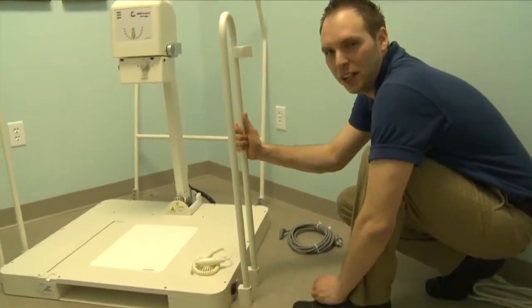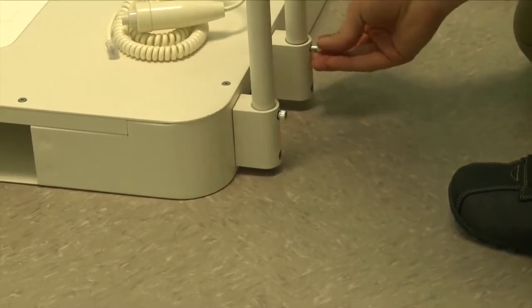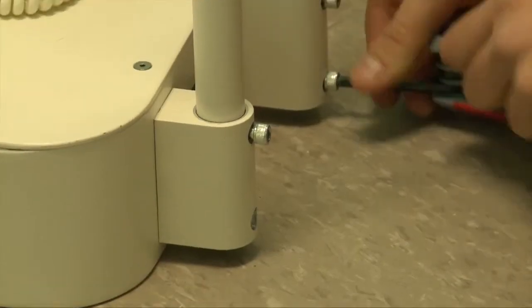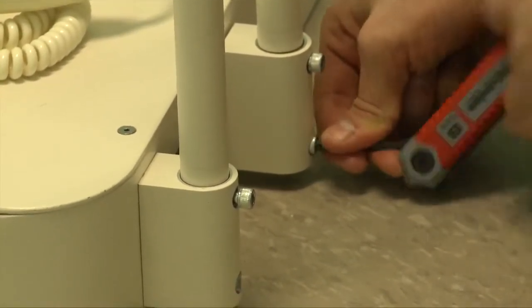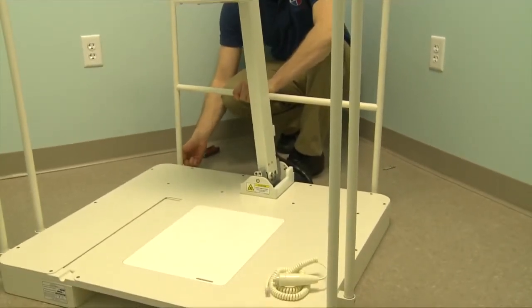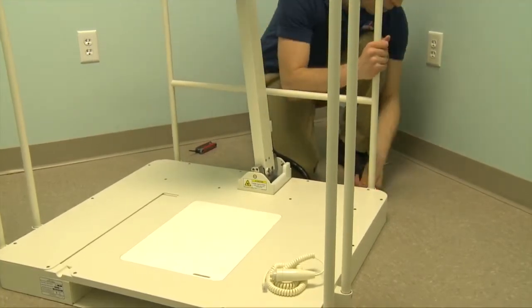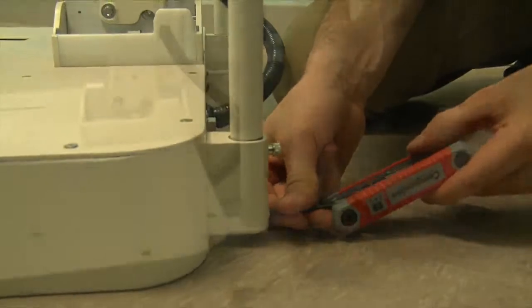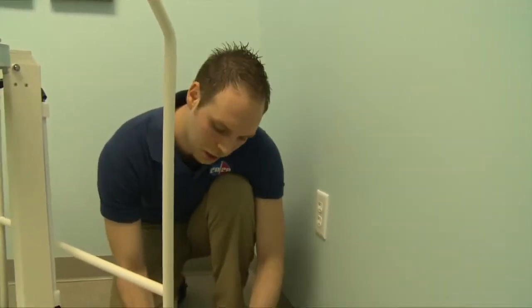And on to the other side. Moving to the back of the unit, installing the handrails to the back. Make sure all the screws are tight before moving to the next step.